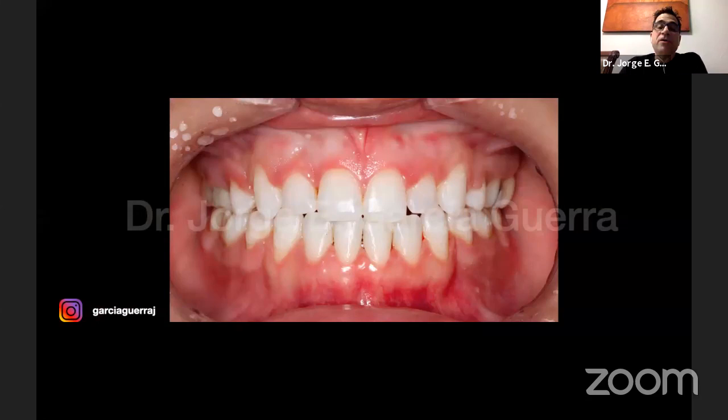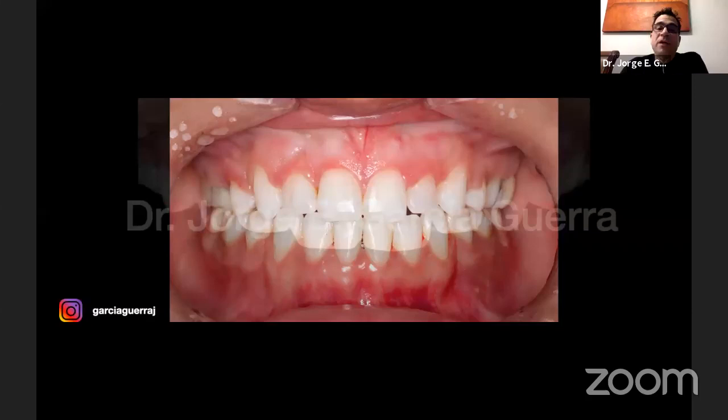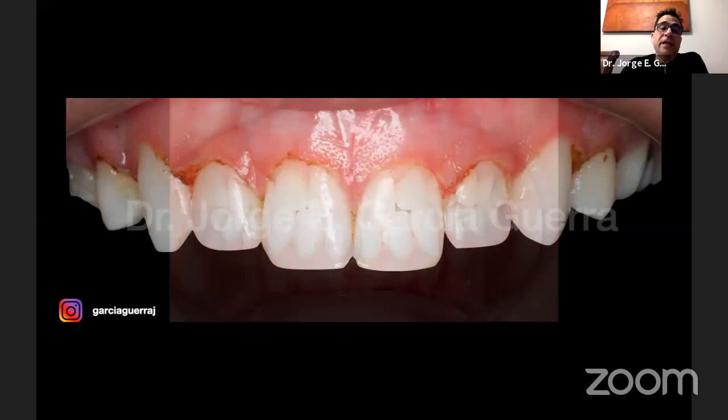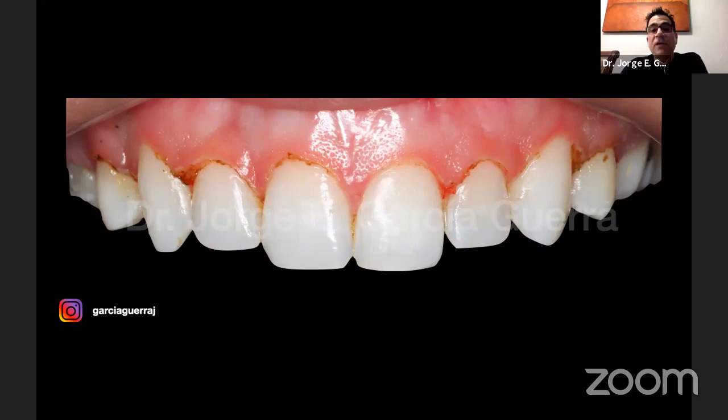We suggested the patient have some composite restorations on the laterals. She didn't want any of the treatment, but what we did with this patient was some gingival recontouring. We already had the laser, and you can see how clean and easy it is to take that excessive gingival tissue, and that helps us have a more aesthetic smile.